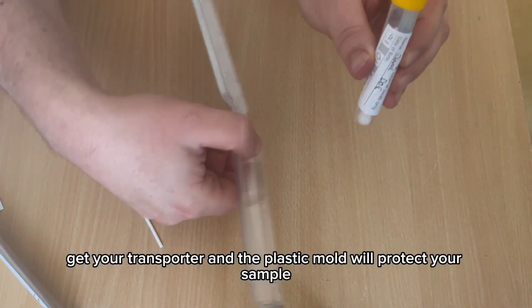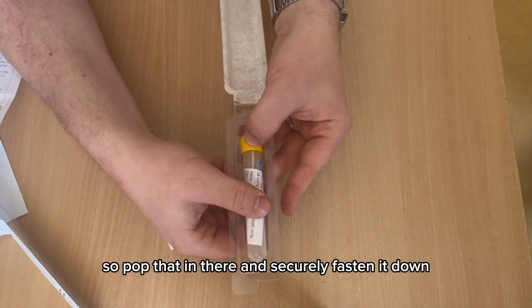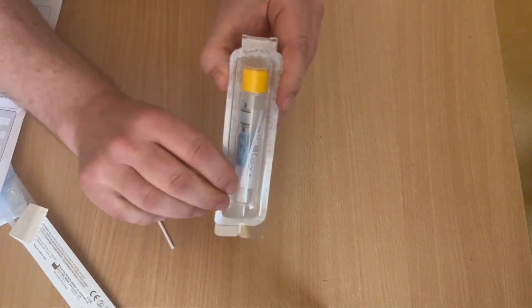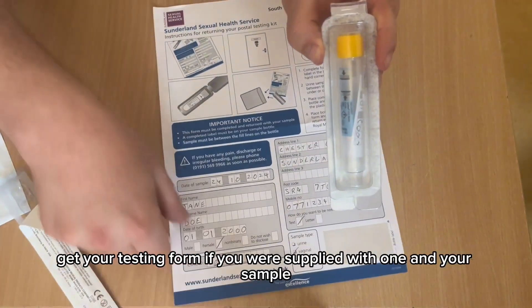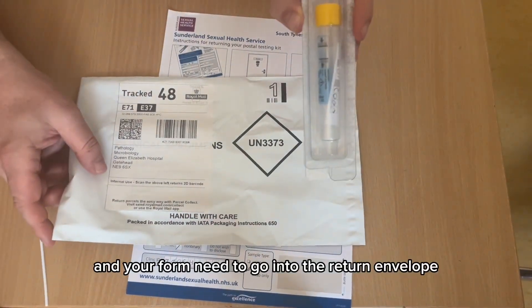Get your transporter — the plastic mold will protect your sample in the post, so place the bottle in there and securely fasten it down. Once that's in place, get your testing form if you were supplied with one, and your sample and form need to go into the return envelope.